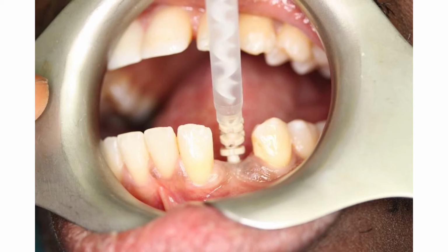So it's most important. If you don't position it on top, then the impression material will run around the transfer but not through the transfer. And it's by running the impression material through the transfer that you lock it into the tray, and that improves the accuracy, and that's the way it's been designed to be used. So don't just syringe it around, also inject it through the transfer as well.